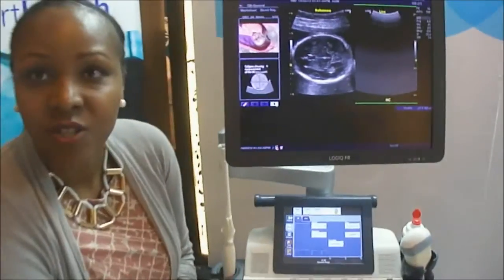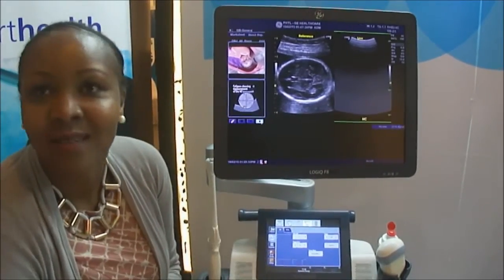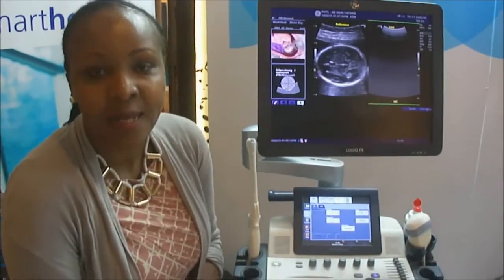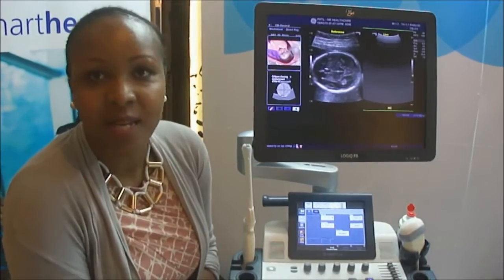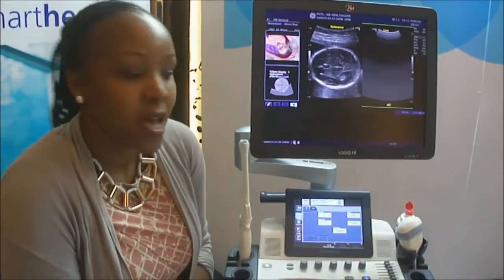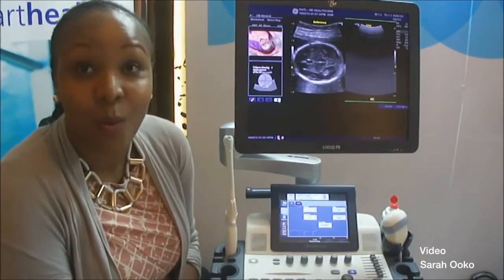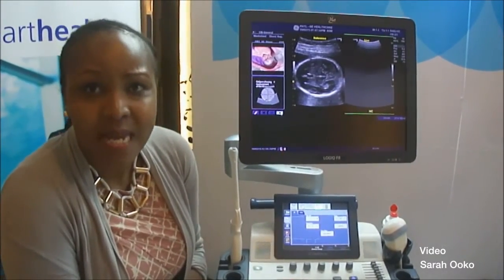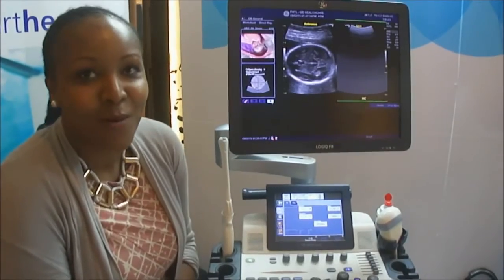The auto-optimization means if the sonographer has not been doing this before, they just need to click one button and the machine automatically does it for them. Any doctor interested in buying the machine — it's not just for the counties — can reach out to us at GE, General Electric, on General Matenge Drive. We have really good payment plans. This machine has a three-year warranty, which is very hard to find in the market. You get training, three-year warranty, and we work with banks to help you in-house. It's a one-stop shop.